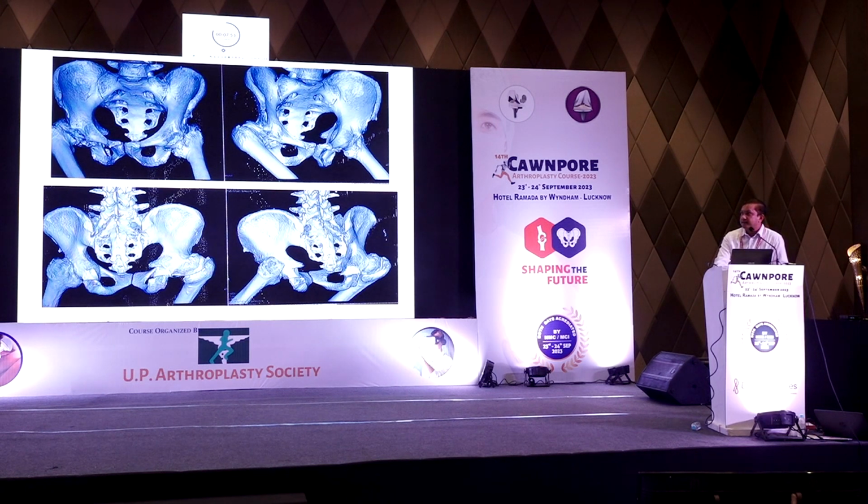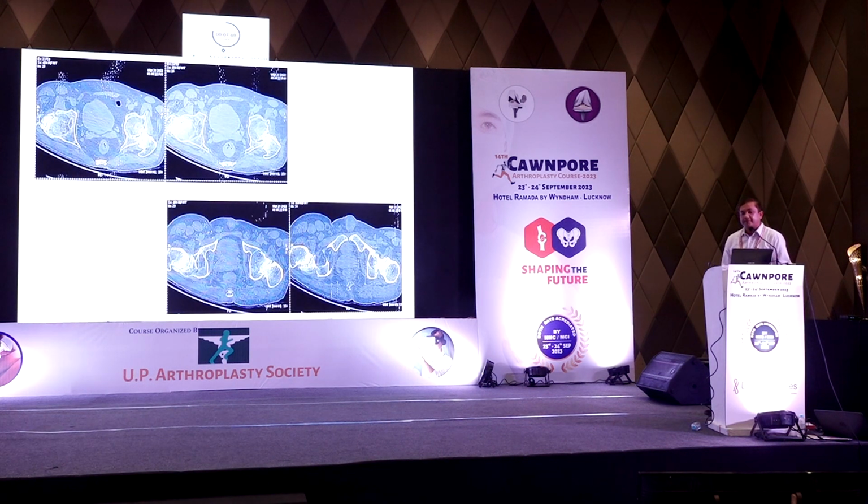Do you have the sections of the CT showing? Yes, sir, we have. Almost fused. So that is not bony ankylosis. That is basically almost. Yeah, it's a fibrous situation. Very good.